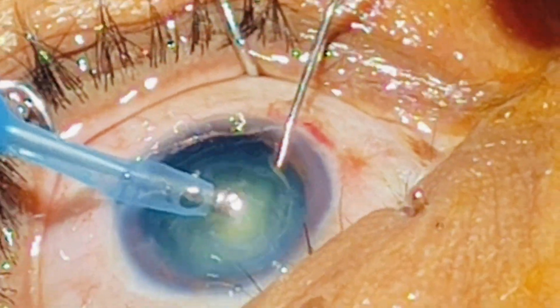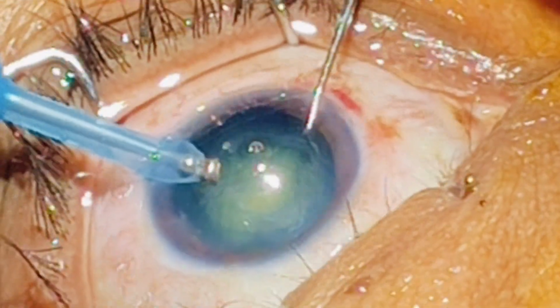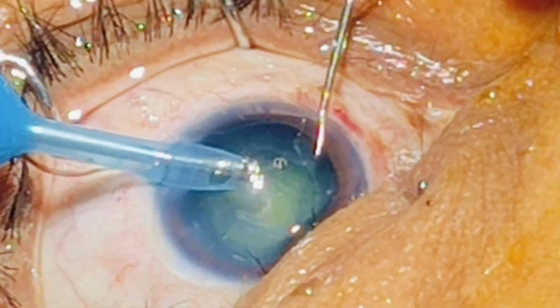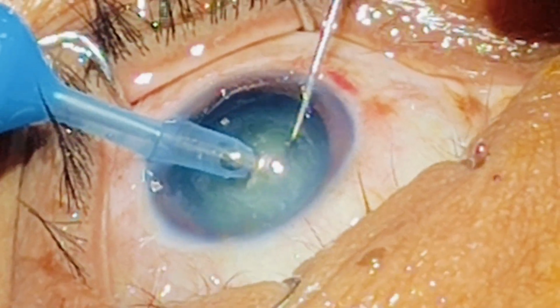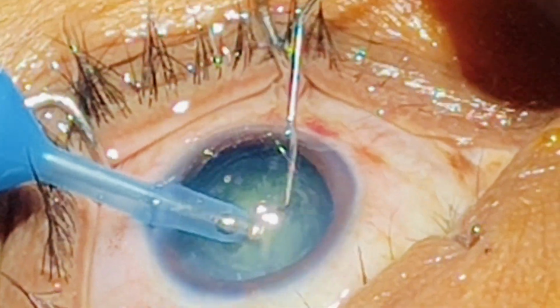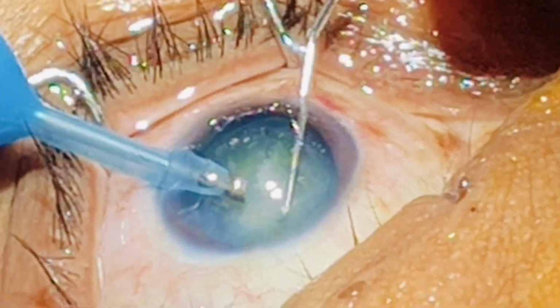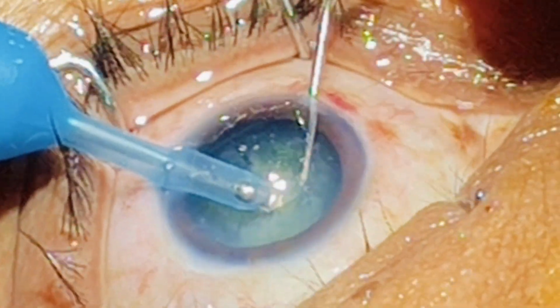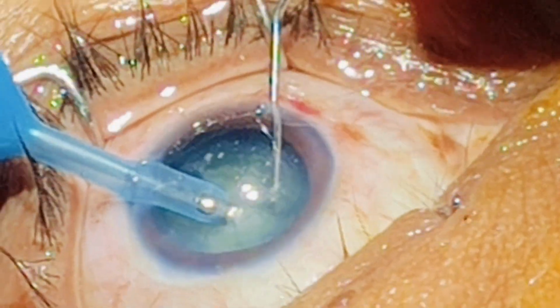So here I'm just making a small groove. I'm catching hold of the nucleus, doing my first job. See how nicely it got separated. If we make a trench or a groove at ideal depth, then we can proceed easily with the further steps. So now each heminucleus I am dividing into further smaller fragments.